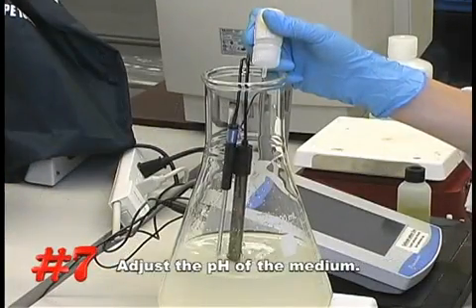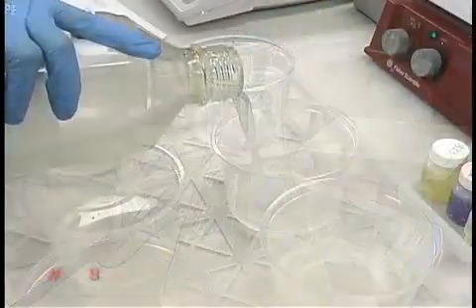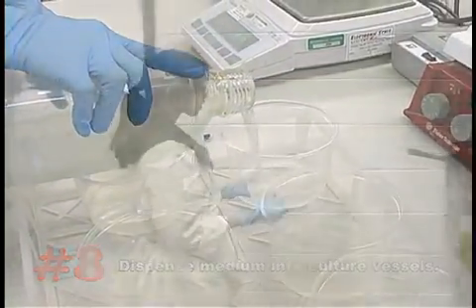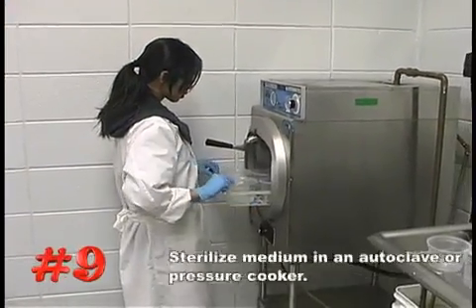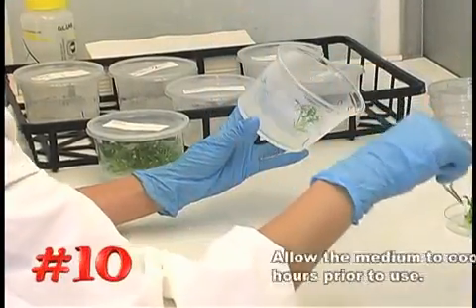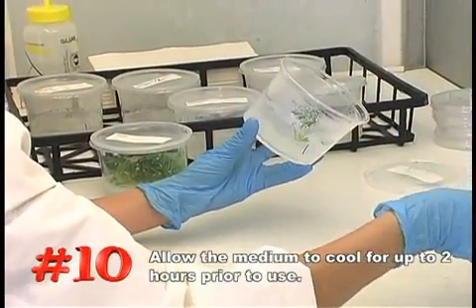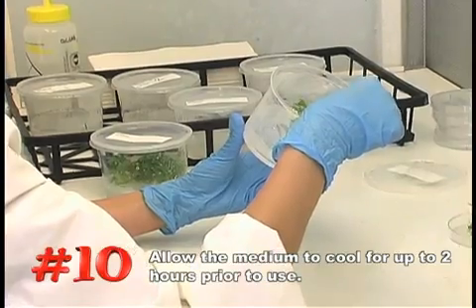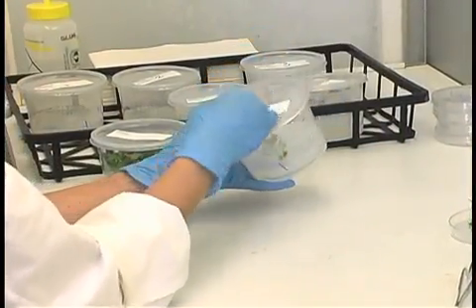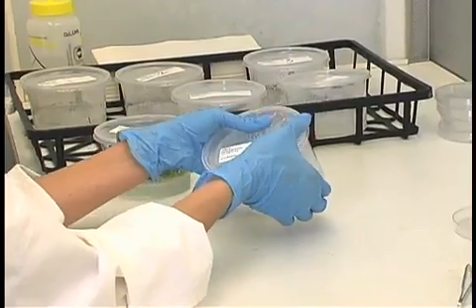Number seven, adjust your pH. Number eight, dispense into final culture vessels. Number nine, sterilize the medium in an autoclave or pressure cooker. Number ten, allow the medium to cool for up to two hours or until the gelling agent is completely solidified prior to use. Following these simple techniques should make your medium preparation process a success.